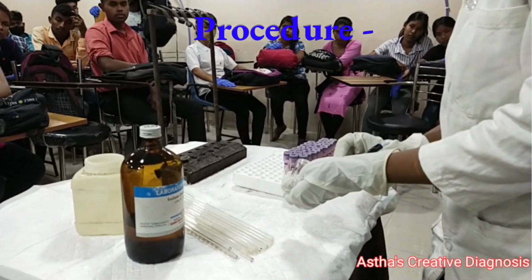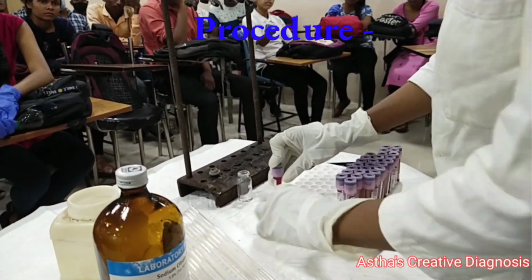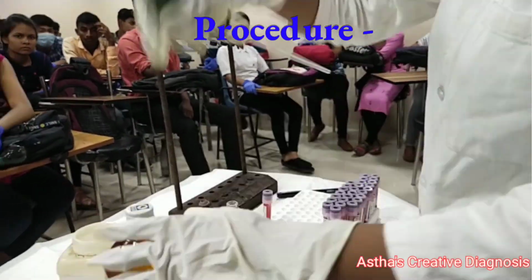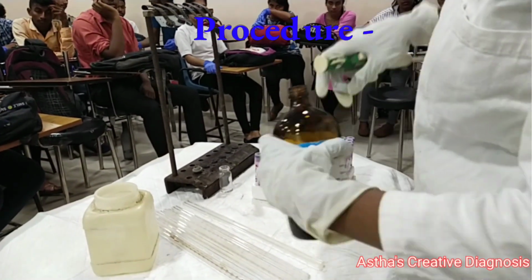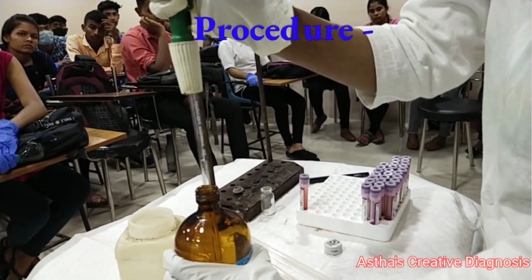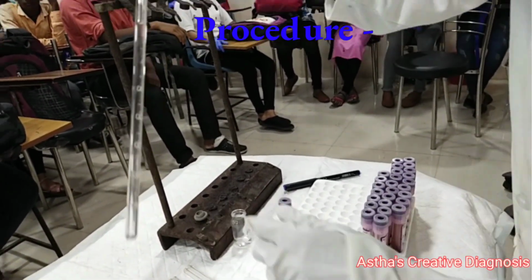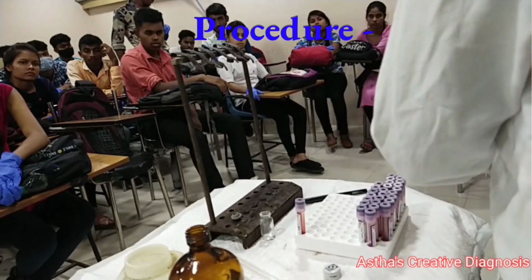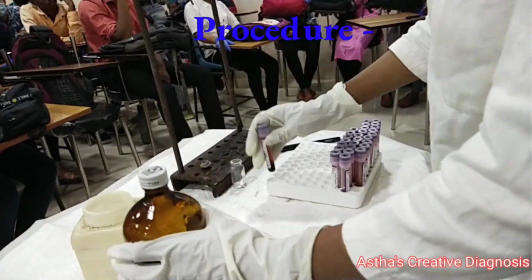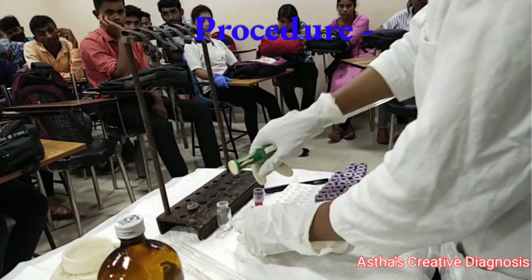First of all, mark the container. After that, mark the 50 mark of the Westergren tube. Take 3.8% trisodium citrate in the container. Then, after properly mixing the EDTA mixed blood, take blood up to the 200 mark and mix it.